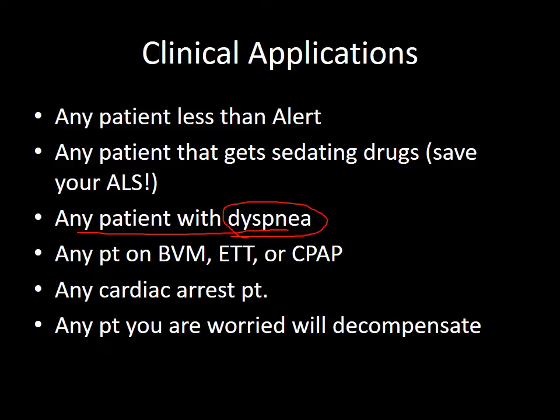Any patient that you are ventilating, or they're on CPAP, or you have to do an advanced airway, they should definitely get capnography. And any patient in cardiac arrest, because that can tell you not only do you have an airway, but it also tells you how well you're doing CPR. And just any patient that you're worried will decompensate.